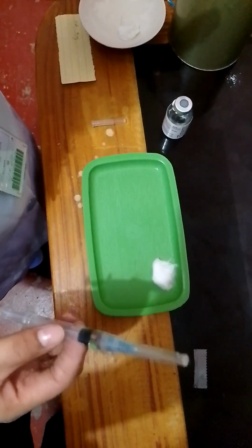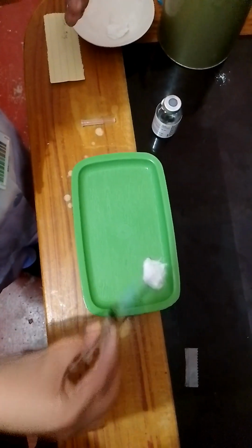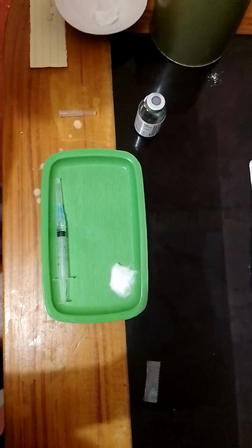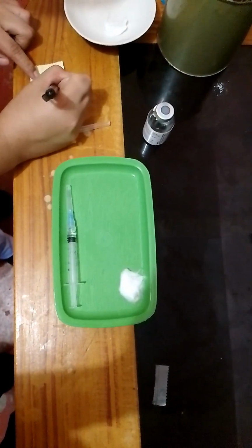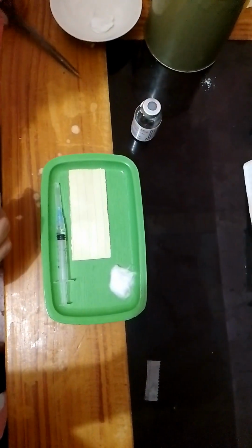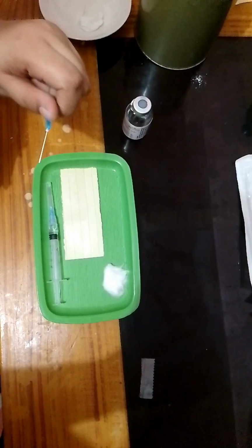And then after that, place the syringe in a hypodermic tray. And then write the name of the drug and its dosage. And then after that, discard the used aspirating needle to avoid needle injuries.